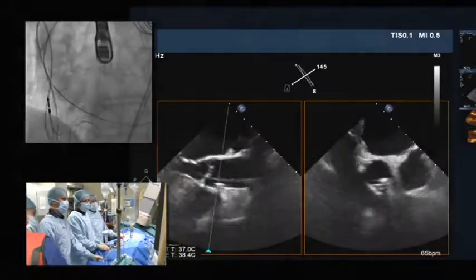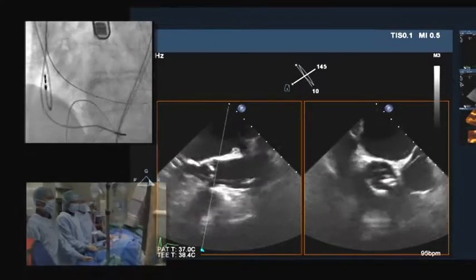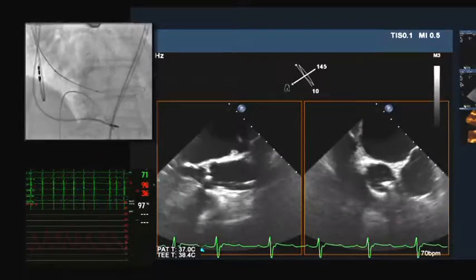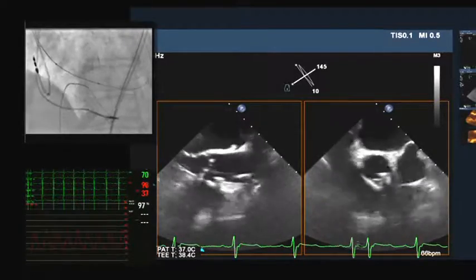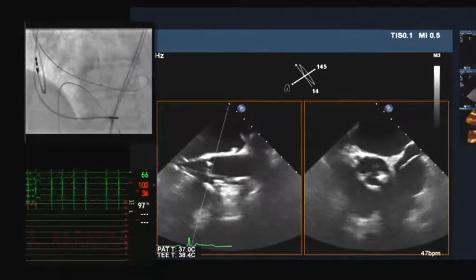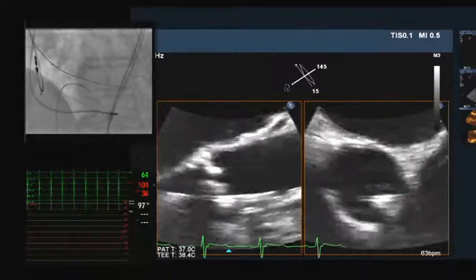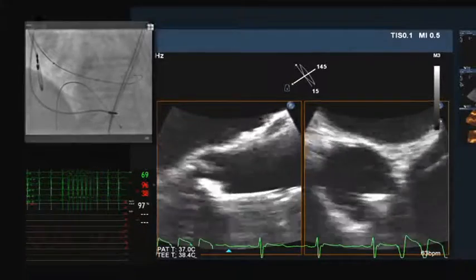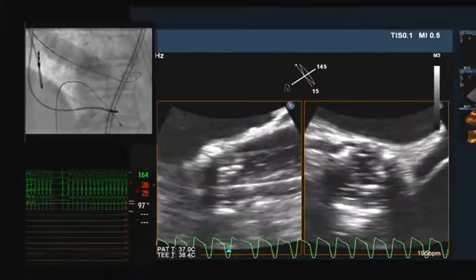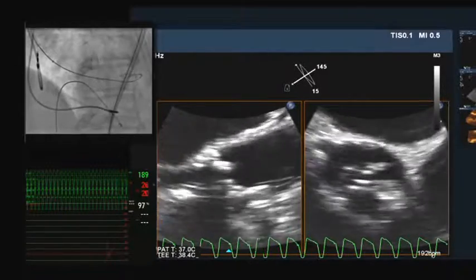So we're going to cross this valve now. So Mark, the uninflated balloon is crossing the valve. Just centre us up there, Greg. Okay. Pressure is good, ECG is stable. There's not much wire beyond it, but okay. So we're ready to go now, Raghu. I want 10 volts output, 180 pacing on, please. 180. Bit of hush in the room, thanks. Pressure's coming down, and up we go, John. Nice and gently does it. And pacing off, thank you.